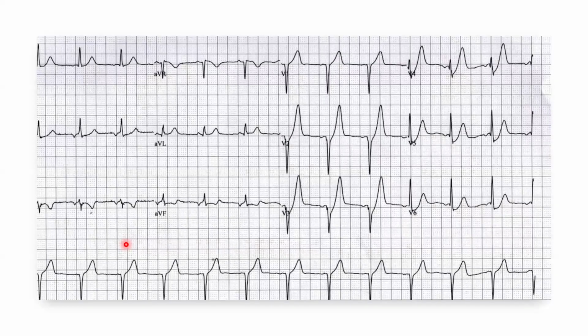Here we have the tall T waves in the precordial leads. We have an upsloping ST segment depression, and we have 1 millimeter of ST segment elevation in aVR.